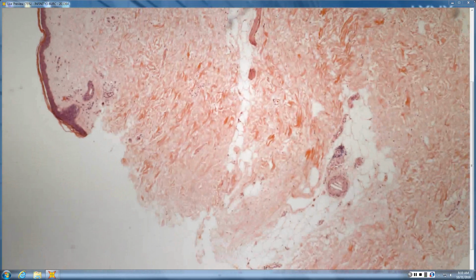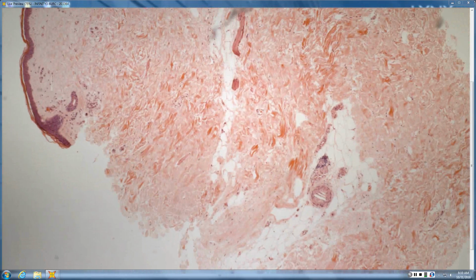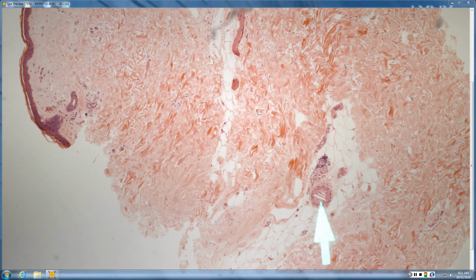Okay. Nicole, what do you see? So, starting from the top, the stratum corneum and the epidermis look fine. There's not really much of an infiltrate in the papillary and reticular dermis. Yep, agree. Oh, there's something going on in that. Yeah, I don't see it, oh, there it is. So what is it? Clefting, so I would think maybe like a cholesterol embolus or something.